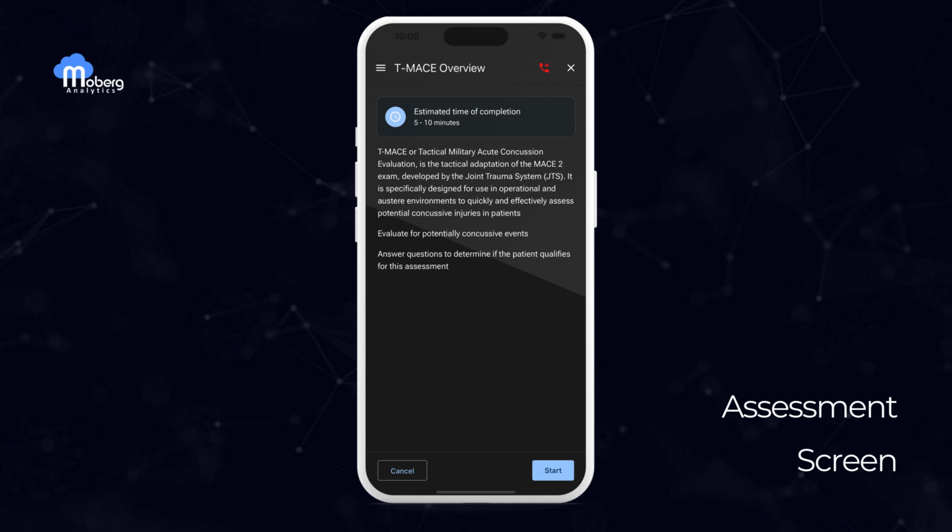T-MACE, or Tactical Military Acute Concussion Evaluation, is the tactical adaptation of the MACE-2 exam, developed by the Joint Trauma System. I'll go ahead and tap Start to proceed.